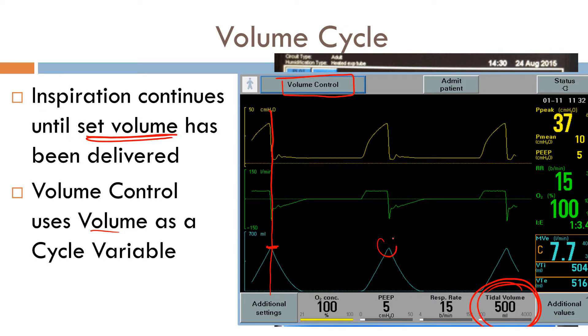Just scan up. 500 cc, it stops delivering your breath. 500 cc, it stops delivering your breath. 500 cc, it stops delivering your breath. So in volume control ventilation, the cycle variable is volume.